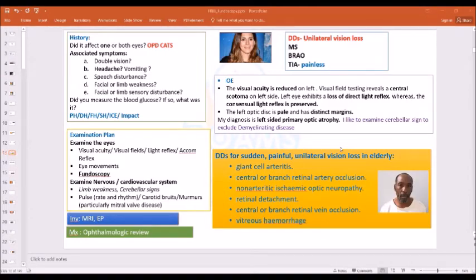The very, very important skill is fundoscopy. The examiner may guide you. Or if the doctor wants to do something more, even then it is better to ask, sir, I want to do this, I want to do this. Practically, they will tell you the finding. Okay, doctor, now go for the fundoscopy. They want to see you. This is the best maneuver to be seen in eye examination.